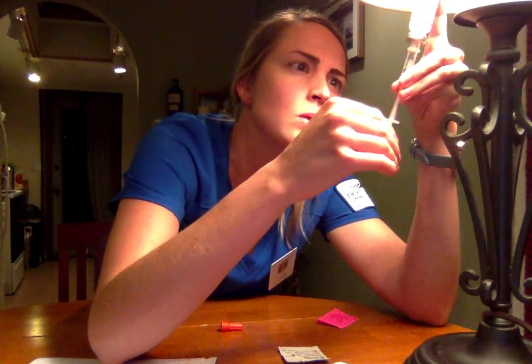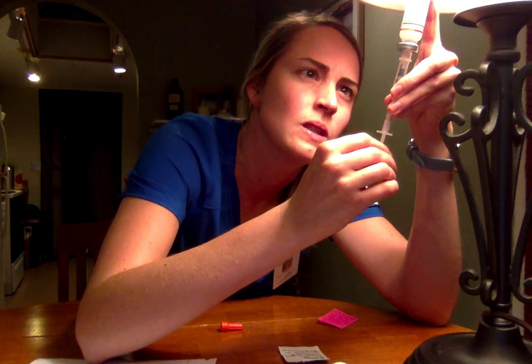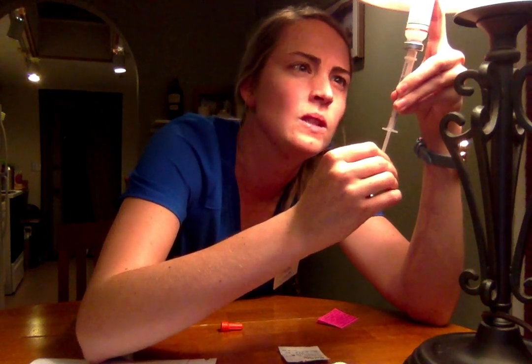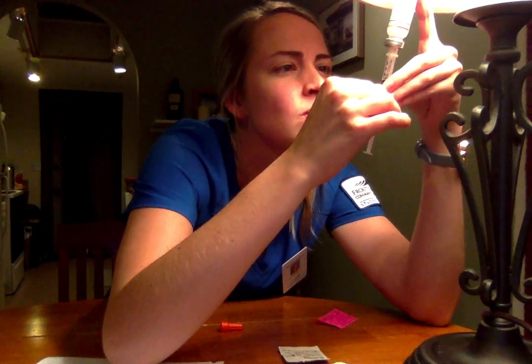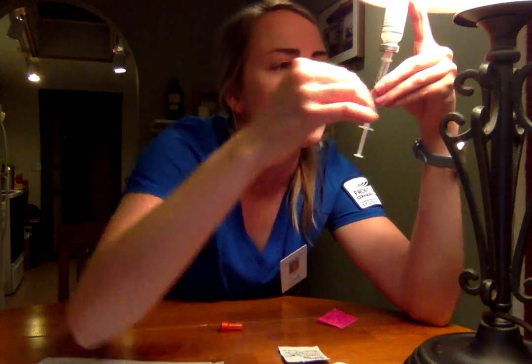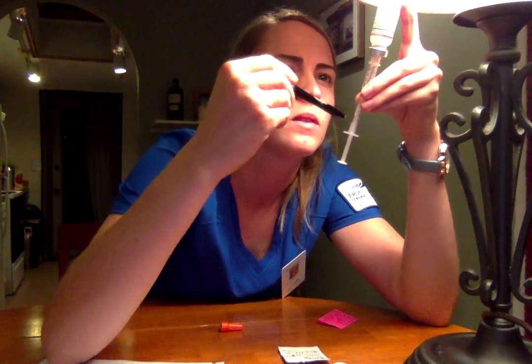We want no bubbles. I'm going to give it a few flips with my pen here.